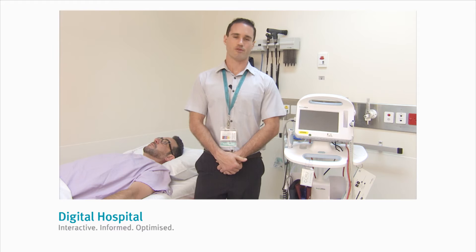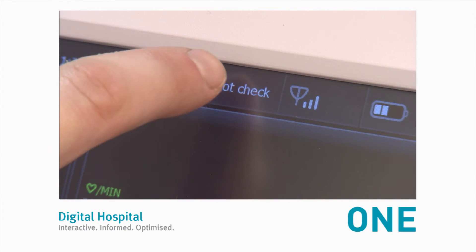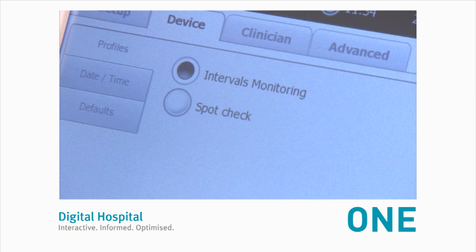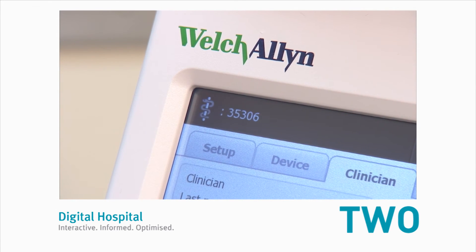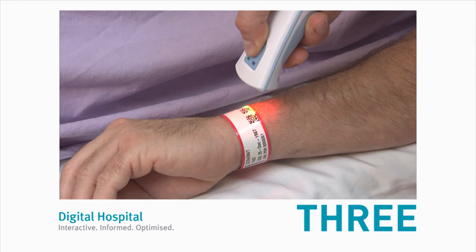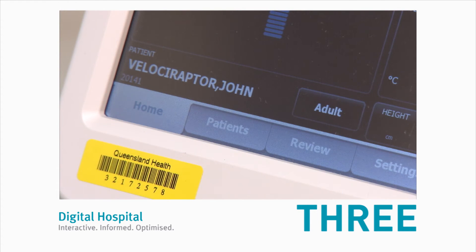Now, let's move on to interval monitoring. Number one, change the monitor to intervals mode. Touch where it says spot-check at the top of the screen and select interval monitoring, then touch the home tab. Number two, touch the clinician ID icon and scan your clinician ID. Number three, scan your patient's ID wristband and wait until the patient's name appears in the lower left-hand corner.